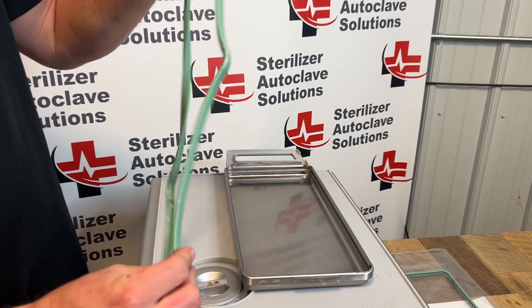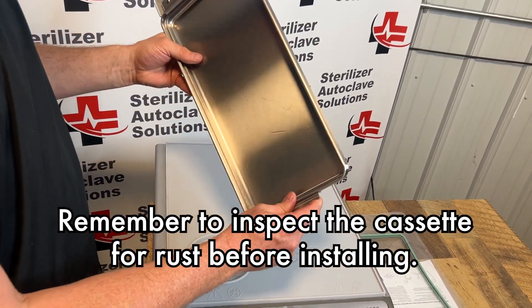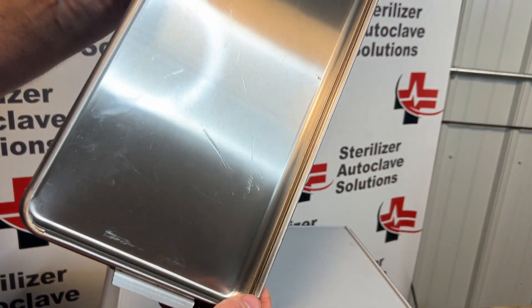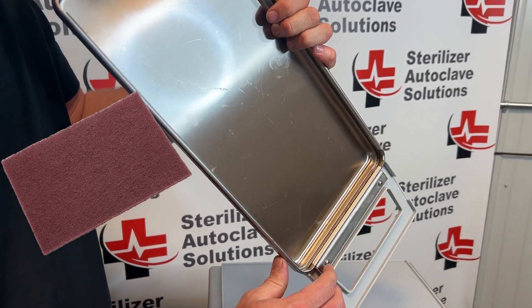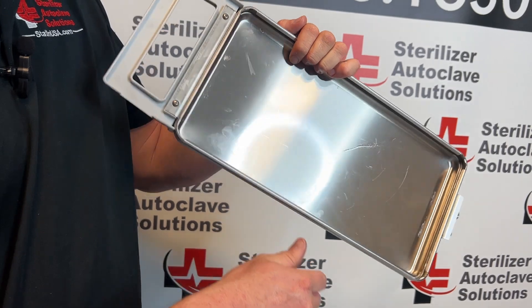This is a new seal, so I will be reinstalling this one. However, we do want to inspect our cassette. Make sure there is no rust or debris anywhere inside this cassette. If there is, you can use Scotch-Brite, Barkeeper's Friend, anything non-abrasive to help clean up that rust. Just make sure you rinse it out.